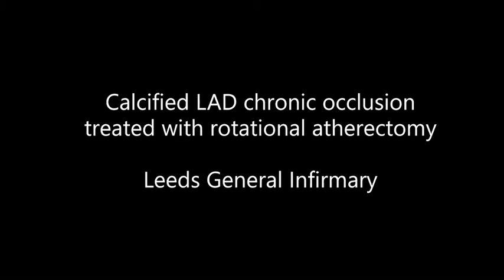This is a case of a calcified LAD chronic total occlusion treated with rotational atherectomy. My name is Dr. Abdul, I'm a consultant cardiologist at the Leeds General Infirmary, and this procedure was performed as a proctored case with my colleague, Dr. Jenny Rossington.